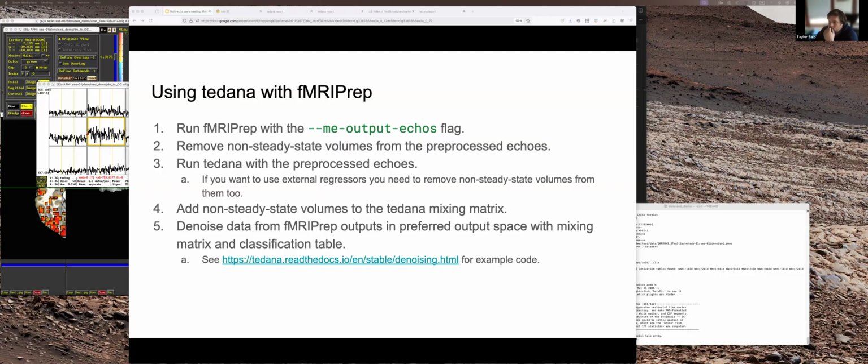Yeah, I think we spoke to this. I won't endorse GSR either, period. But including aCompCor as separate regressors, you're probably reducing your degrees of freedom in the output a little bit, but until we have a decision tree that really works well with aCompCor regressors and we know the right thresholds that will apply across data sets, that seems totally reasonable to me. And that seems to be the end of the unanswered questions.